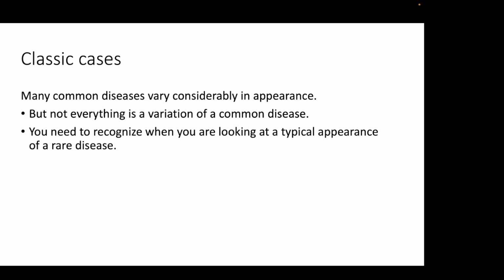So if I'm very suspicious it's a metastatic lesion, but I'm still not certain, I might bring them back in 4 weeks. If I think it's a capillary telangiectasia, then I might wait like 6 weeks or 8 weeks. I think you have to develop your own style that way. But I don't think you'd be going too wrong by saying 6 weeks. It's probably enough time for most tumors to change, and not so much time that we should worry about a tumor enlarging to the degree that the patient may get symptomatic from, say, seizures or ventricular obstruction.